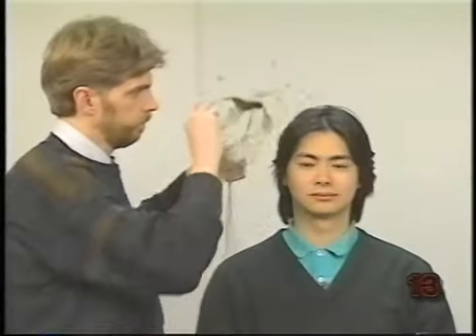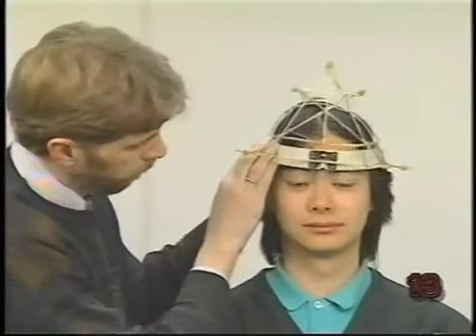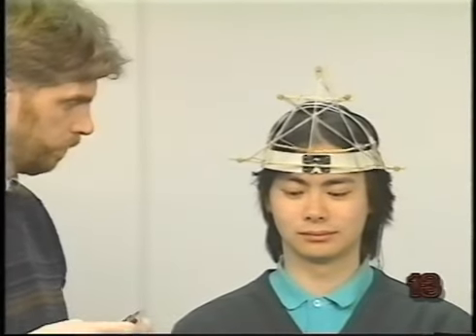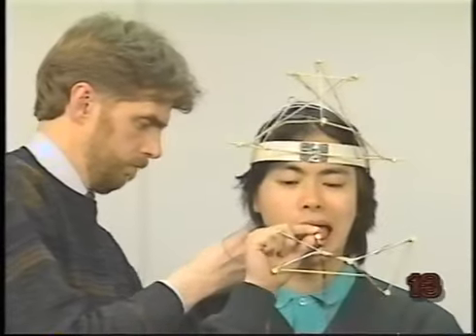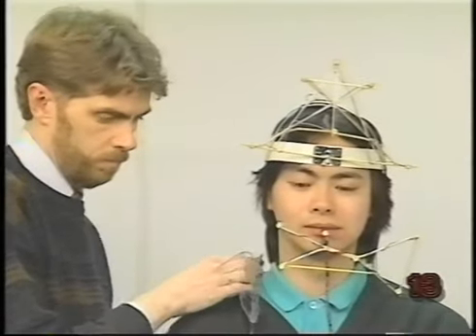The final experimental demonstration shows the system's ability to make complex coordinate transformations needed for rigid body analysis of the individual components of the jaw's 3D motion. Markers are attached to sturdy lightweight frames that span relatively large distances and which move in unison with the head and jaw.